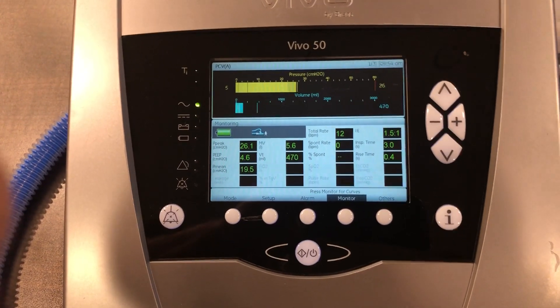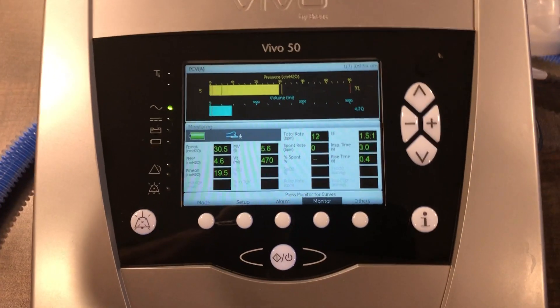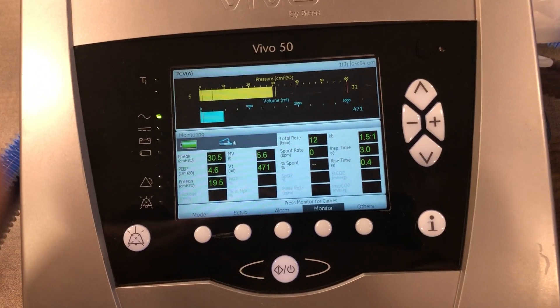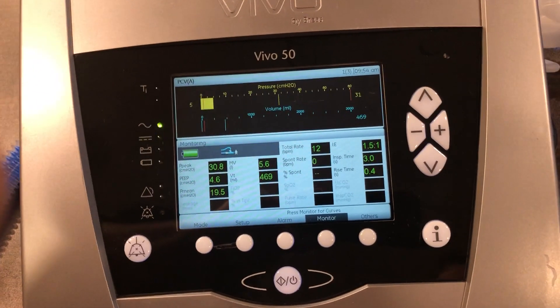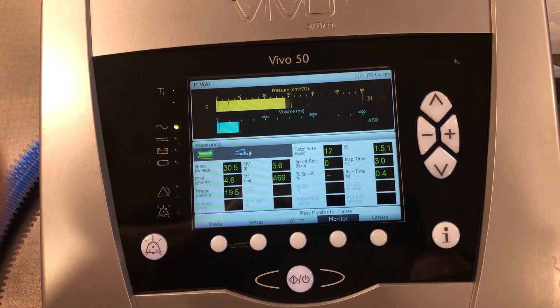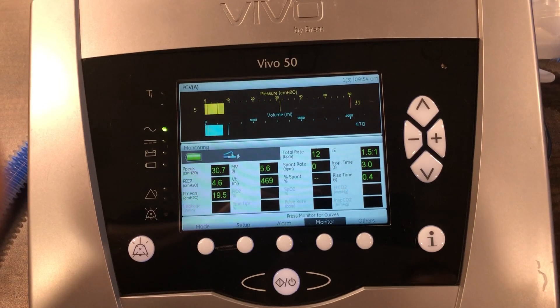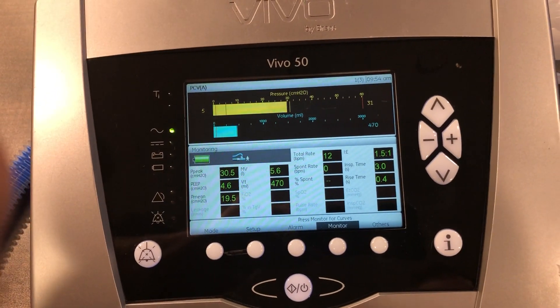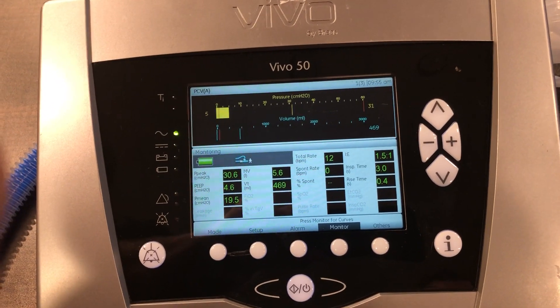Obviously, when you use inverse ratio ventilation, you're going to be dealing with a patient that is sedated and paralyzed, because somebody's body cannot tolerate this type of ventilation otherwise. So that is inverse ratio ventilation on the Vivo 50.